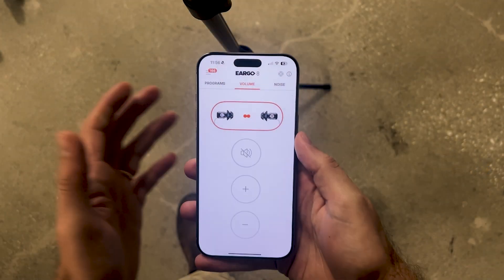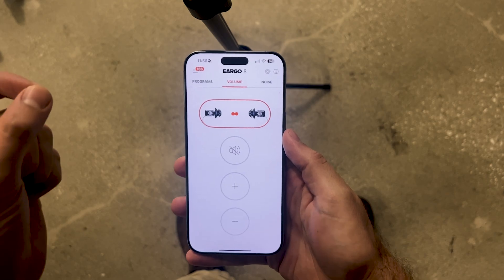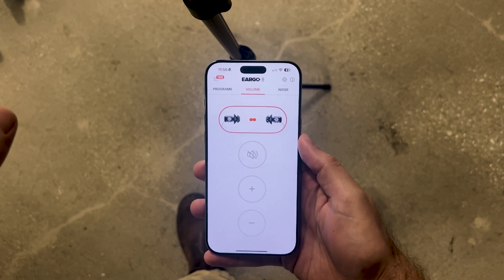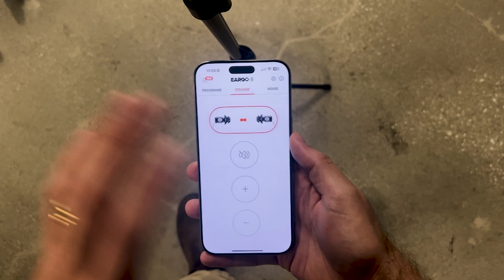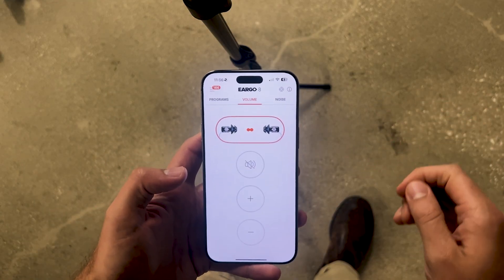Now, if you're planning to follow along at home, before we get started, make sure you've charged up your devices. I charge these overnight, so I'm going to put them in my ears and we're going to begin. Let's dig into the Eargo app. I've downloaded the Eargo 8 version of the app. There is an old version for other Eargo devices, but this is the Eargo 8 app. Let me familiarize you with what the app has available — this is once you're already set up.